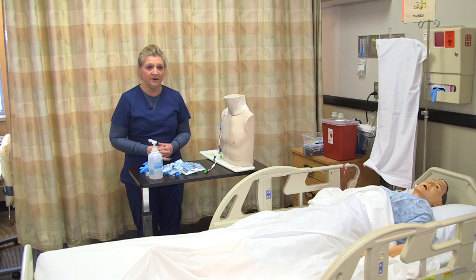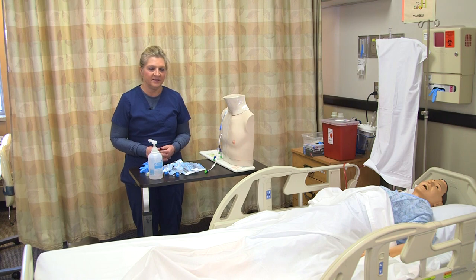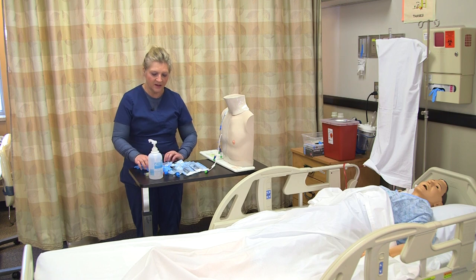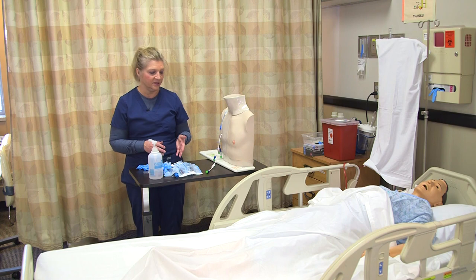I've checked the prescribing order, and I need to draw some blood on a patient who has a central venous access device. I have all my supplies ready before I go into the room. I know that I'm going to need a vacutainer, a couple of the blood tubes appropriate for the blood I'm drawing, a 10 ml syringe, and some saline flushes.